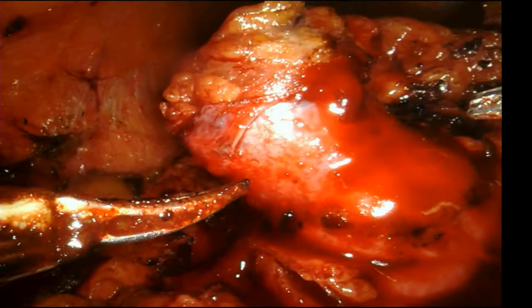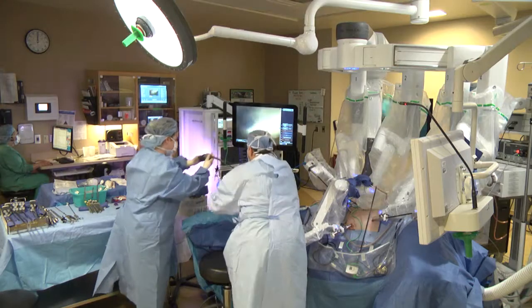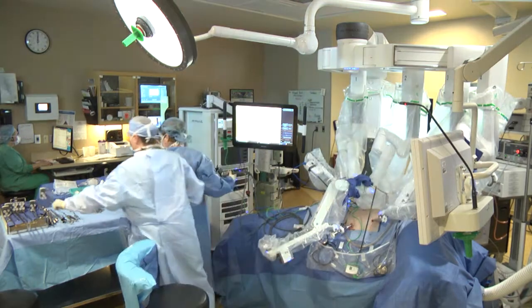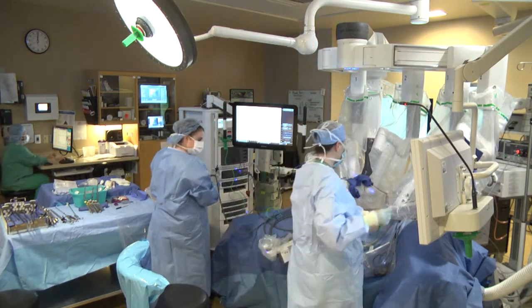Okay, so let's have the scissor back. Let's do one more wipe, and then we'll get ready to clamp. Part of our checklist or our routine is that we pause for prayer. I say P4P, and everybody in the room knows what P4P means. It's not pay for performance. It's pause for prayer. We just say a small prayer before we go on clamp that everything goes well.